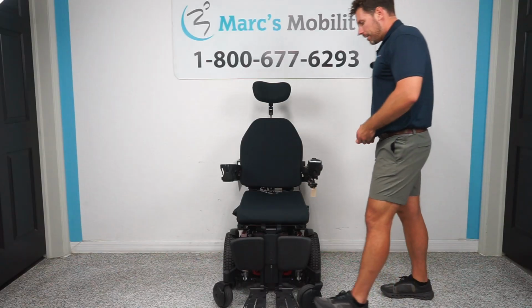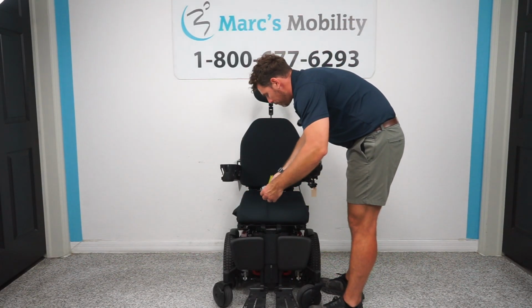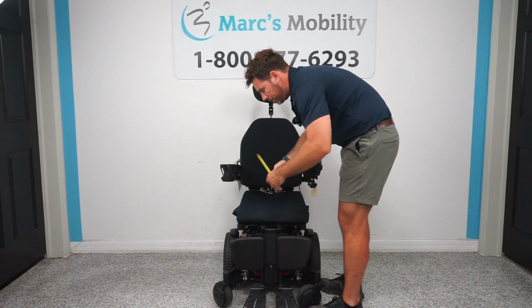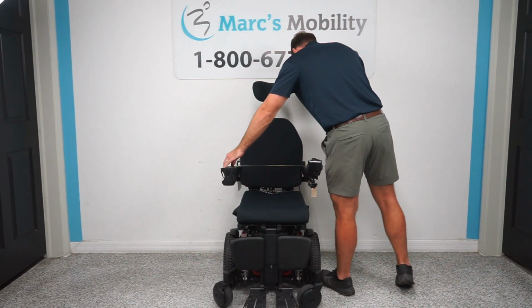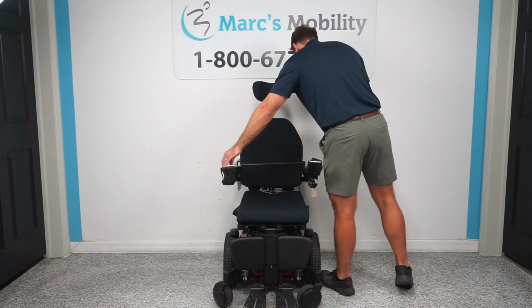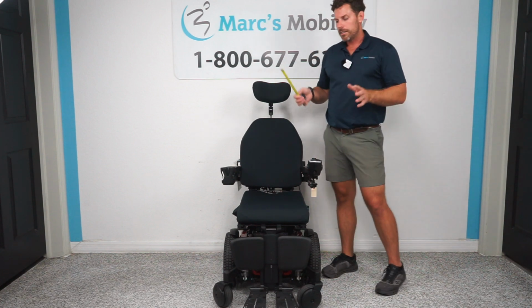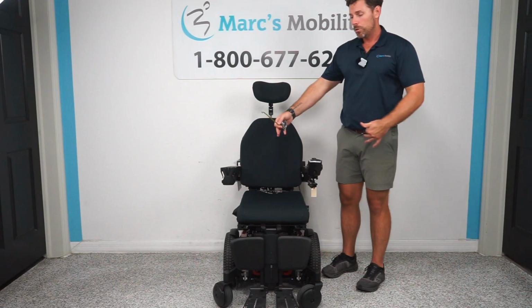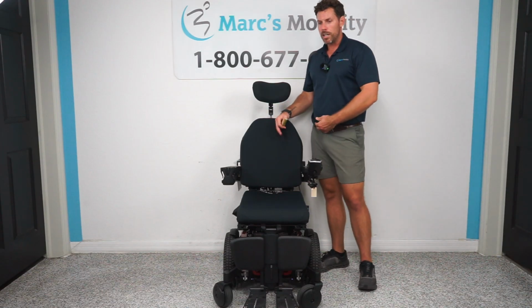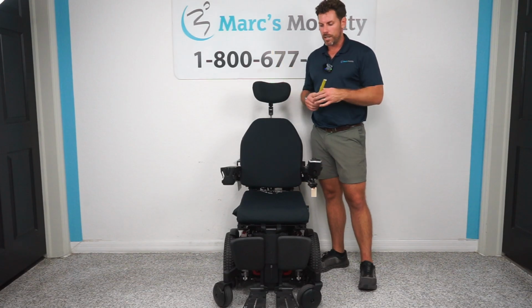Right now, how this was originally ordered for somebody, this has a 16-inch wide by a 20-inch depth seat. That's going to make the overall width of the unit actually only a little under 23 inches, but your wheelbase is about 24 inches. So you need about 24 inches of clearance to go through a door frame with this current size setup. Now, once again, we can go up to a 20-inch wide bottom and a 20-inch wide back, but do know that it's going to push your armrest out wider, so that would increase that overall width distance.